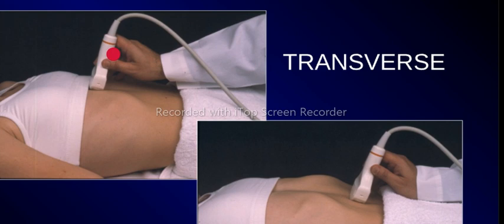That's how we want you to be thinking, and that's the whole purpose of all of this. It's not just to teach you the anatomy as it appears on ultrasound, but also for you to relate with the levels. If I saw this at this level, if I'm able to see such a structure, I know this is what I expect in the neighboring organs, or this is the level where we are. Even if it was a still image sent to you by a colleague and they were asking you about a certain mass or reference, you can be able to tell the level where the scan was done from by looking at the image itself and the landmarks within the image.